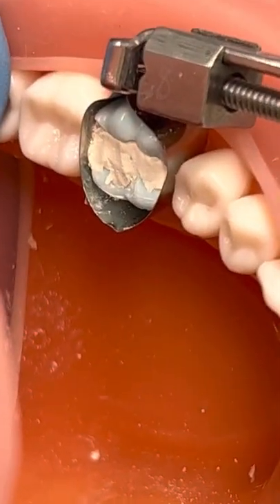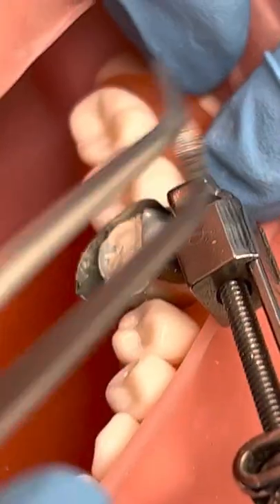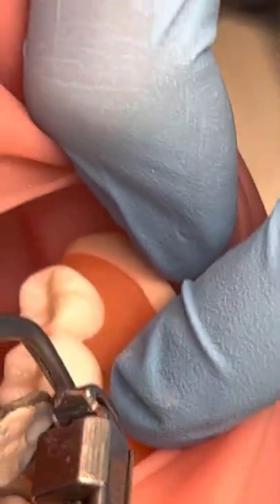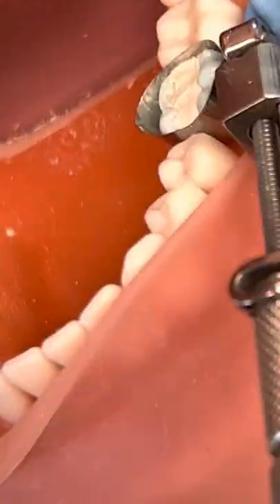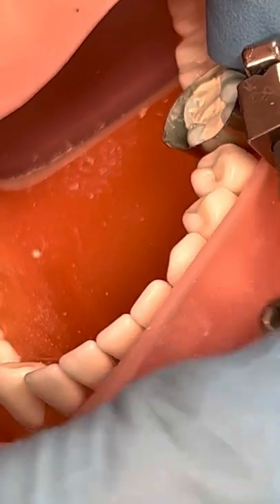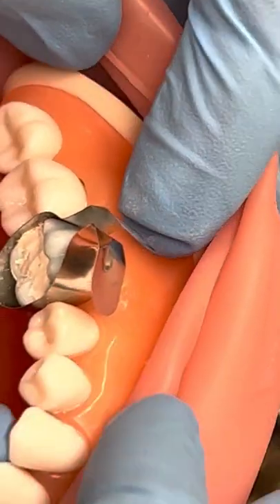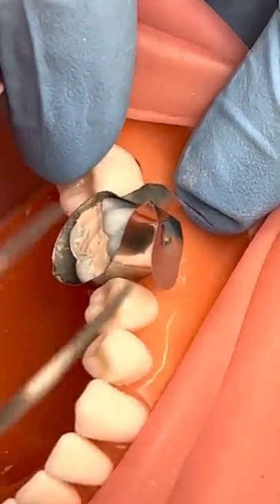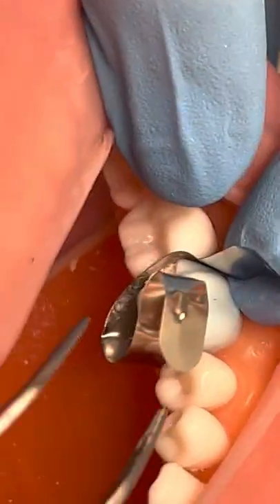The occlusal part is pretty much where we want it, so we're going to take out the matrix system. First remove the wedge — remember your wedge is on the lingual part. Then we're going to loosen the toffelmyer. We'll use our cotton pliers to kind of pull out that band, and you're going to see you saw it out. You don't want to pull it out too hard — on the mesial it's fine because there's no wall we're building, but on the back side you want to be careful not to pull your wall off.